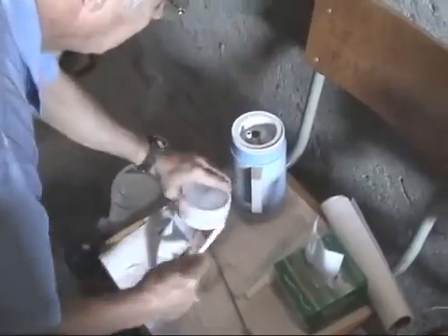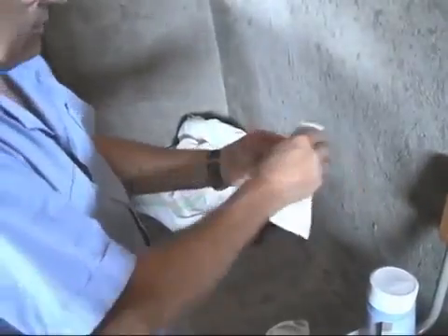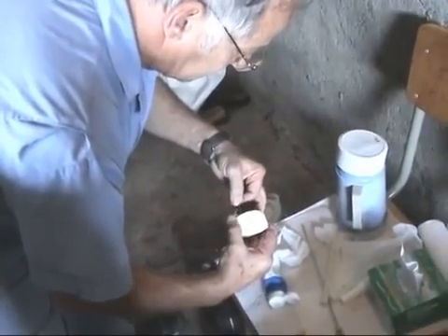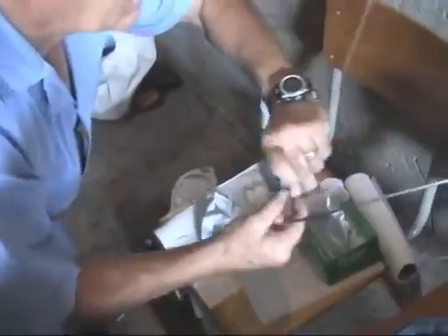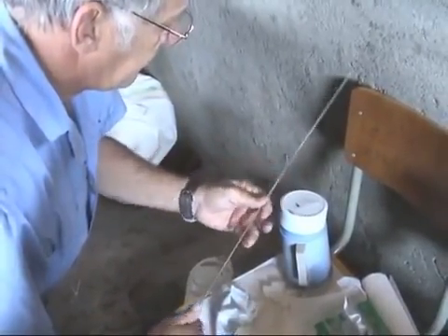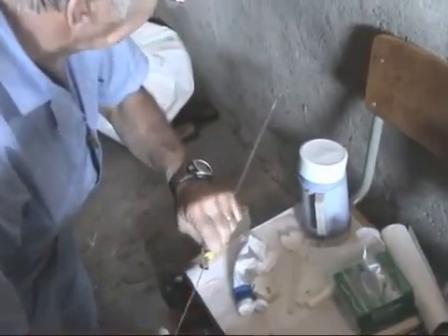We remove the straw from the thaw jar and dry it off, removing all the water from the outside. Then we identify the sire on the straw to make sure we're using the right sire — GRK 126. Correct. Then we remove the clay plug on one of the ends, and load the gun. We put a sterile sheath around it because this is what comes in contact with the tract, and you want to make sure that it is in fact sterile. Lock the semen into place inside the gun, lock the sheath on the barrel, and we're ready to inseminate the doe.